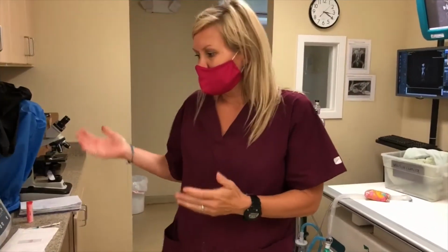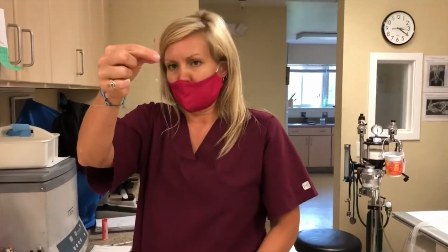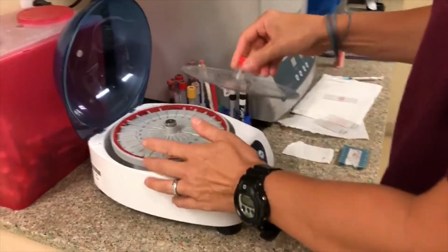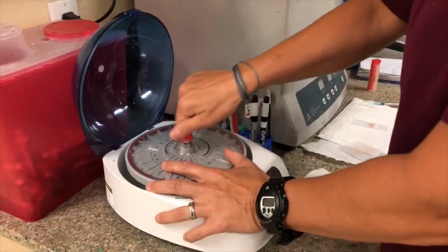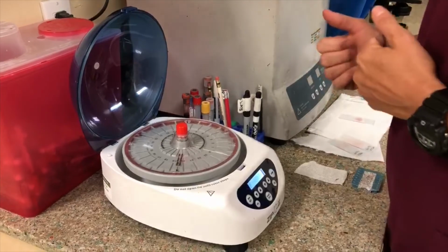This is our lab area. We just had a new patient come in, a screech owl, and we took a little bit of blood from this little guy. So you can see our blood tube here, which is a hematocrit. I'm going to spin that down, and then I'm going to read it afterwards, and we're going to find out what his blood work looks like. It'll tell us immediately what his packed cell volume is and what his total solids is, which can give us a lot of information right off the bat for the vet to decide what the next treatment plan is for this animal.